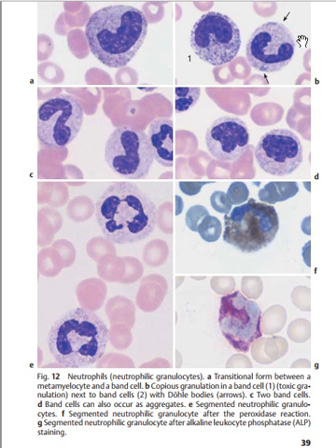Is it clear? So in diagram B, you have copious granulation in band cells. You see, in band cells, more granulation is produced. Why? Because you need to know that the closer you are to the end of hematopoiesis, the more you are condensing your nucleus, and the more you are producing granules or substances in your cytoplasm that will help in the function of that particular cell. Is it clear? That's why the band cell is going to have more copious granulation inside the cytoplasm. Is it clear? So we have toxic granulation.